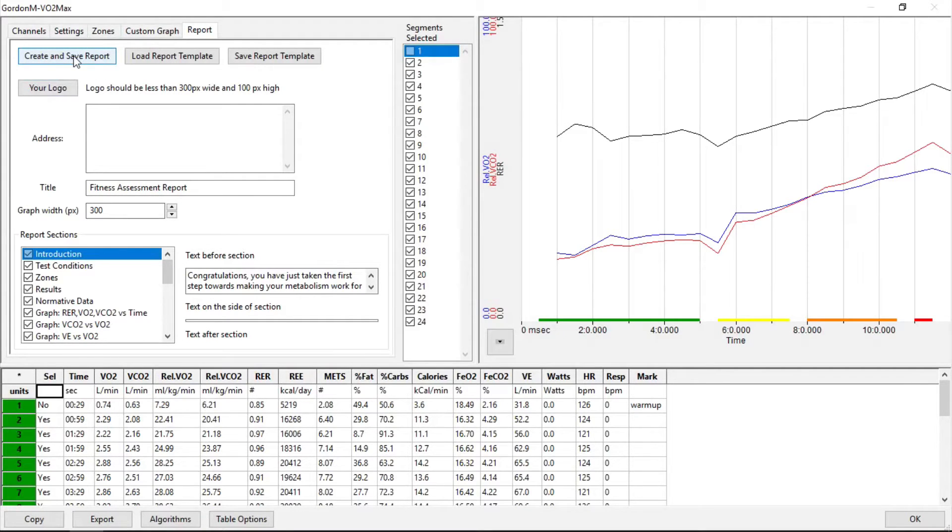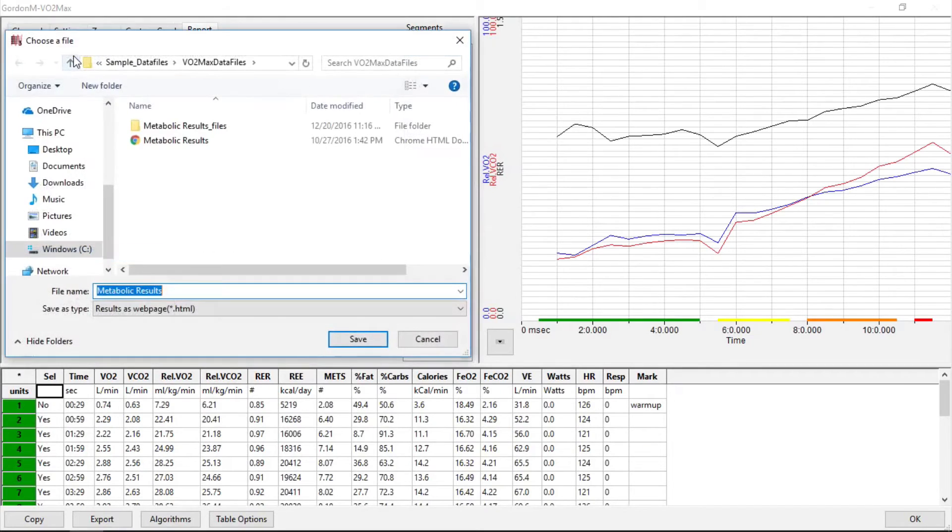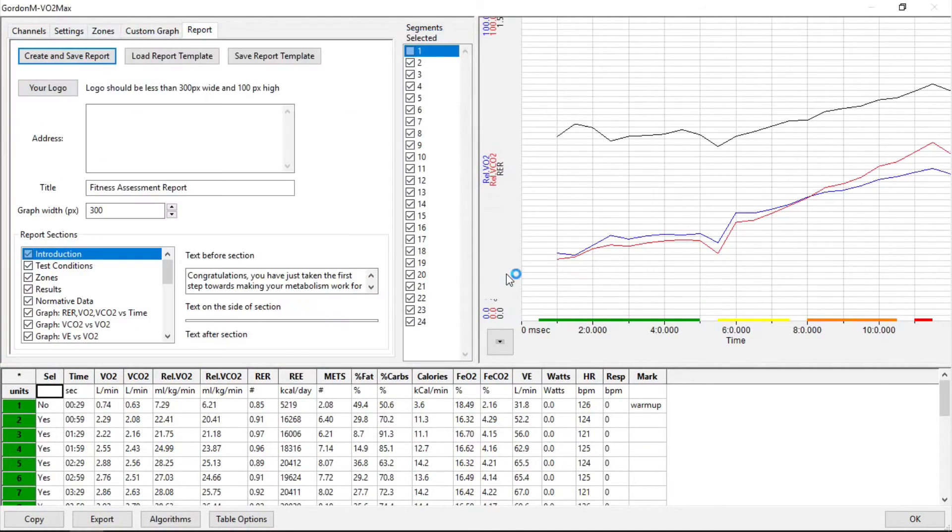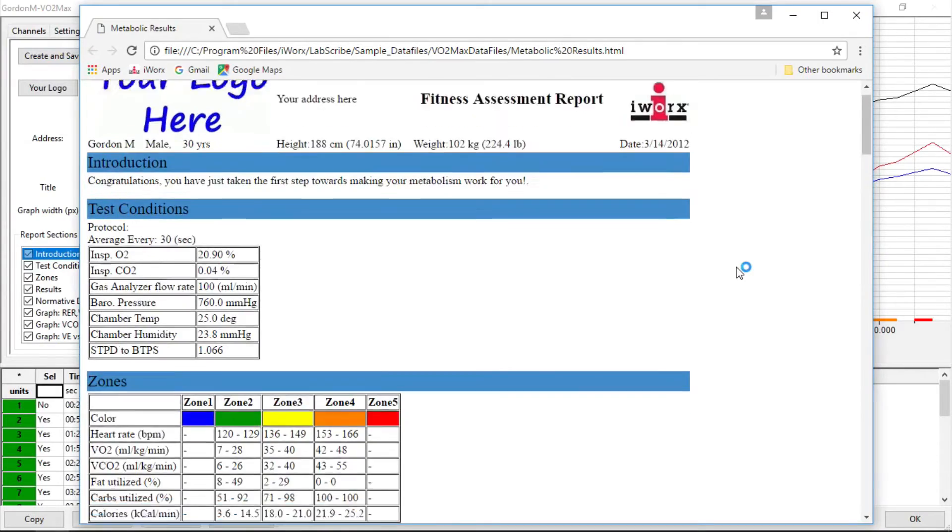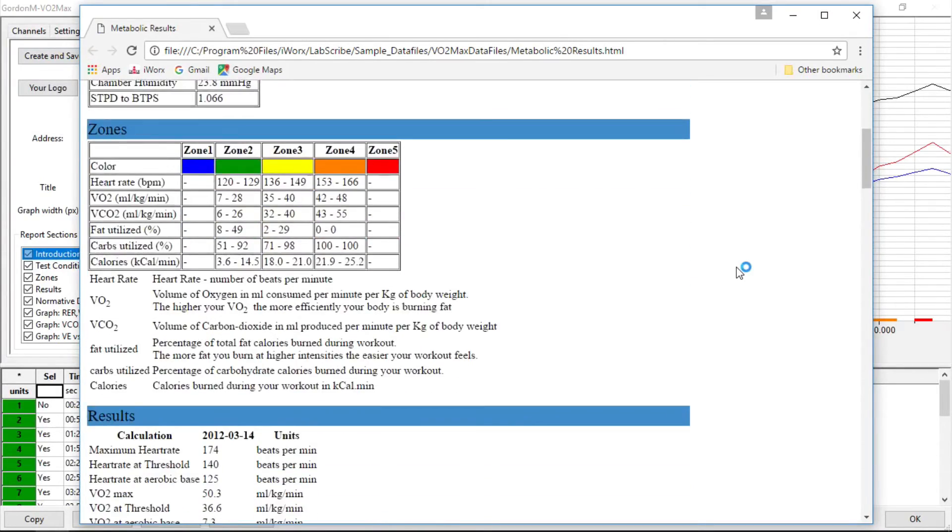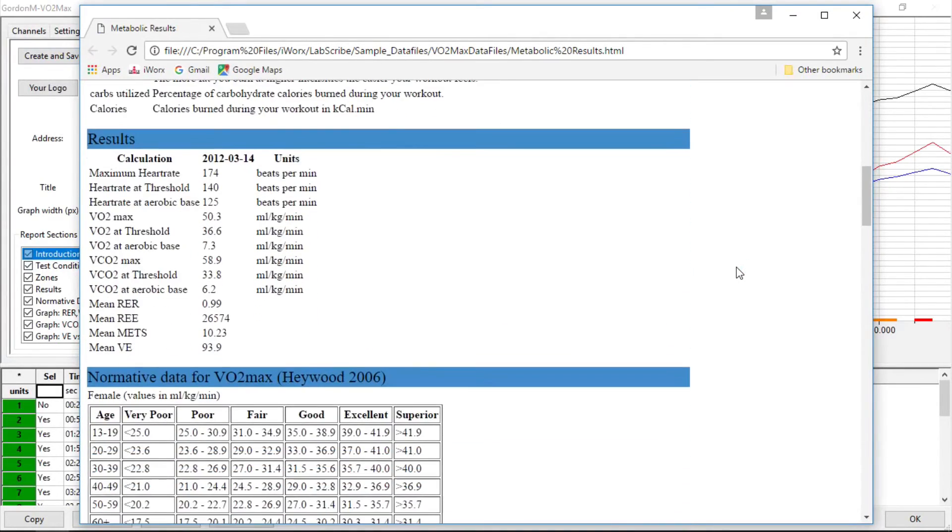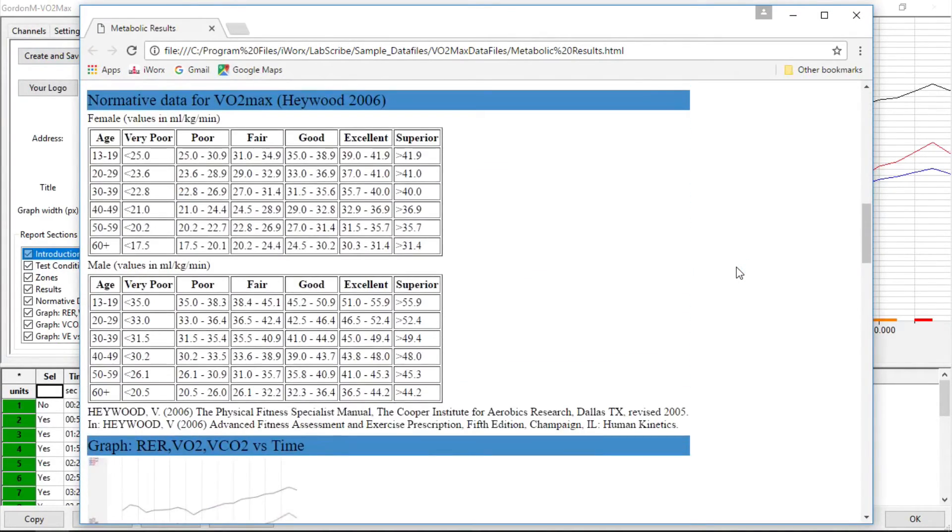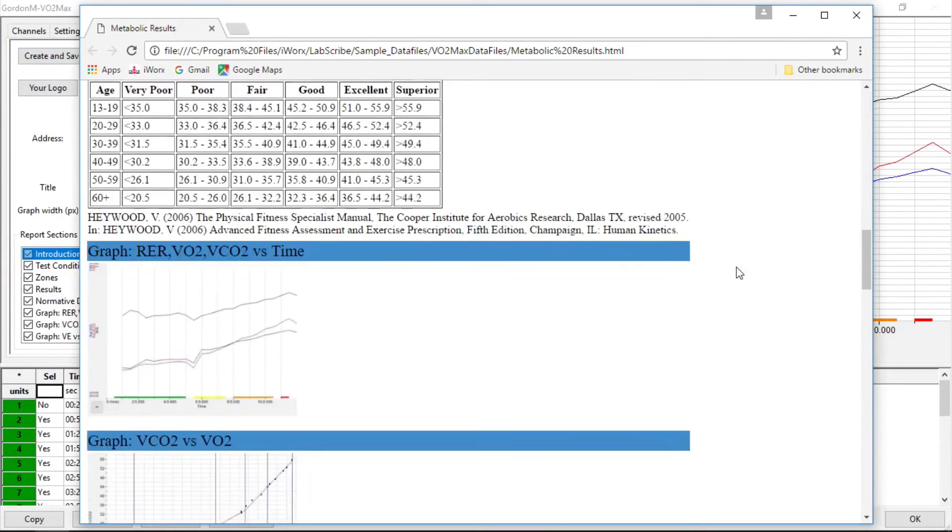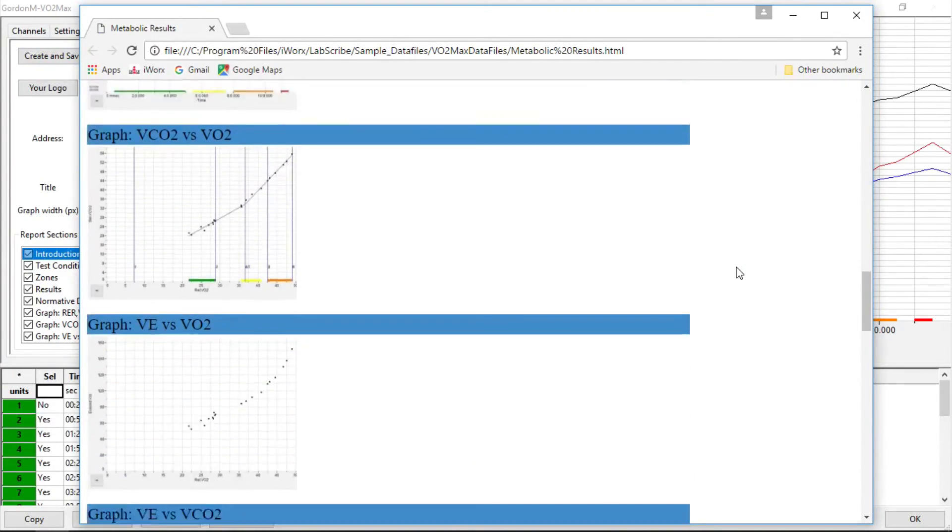But what it does, it assembles all the various portions of it. So here's the patient information, the test protocol, the environment, the zones that we had set up, the results, the normative data based on Haywood, and then all the various graphs.